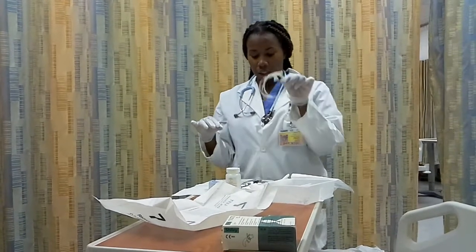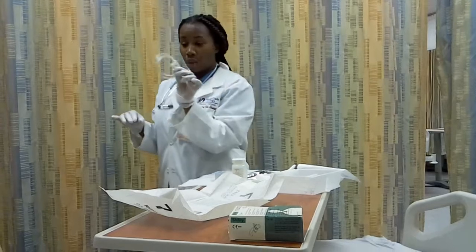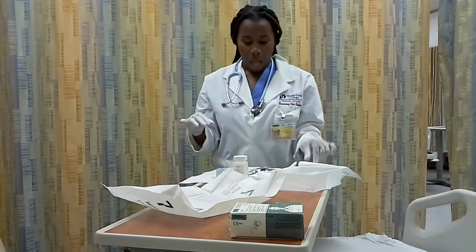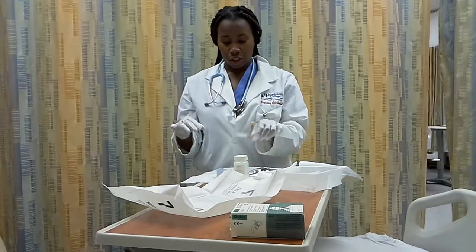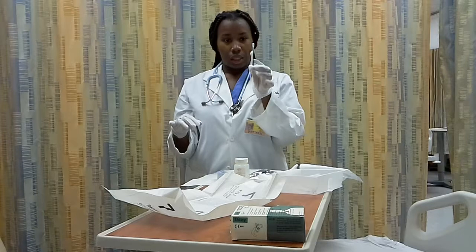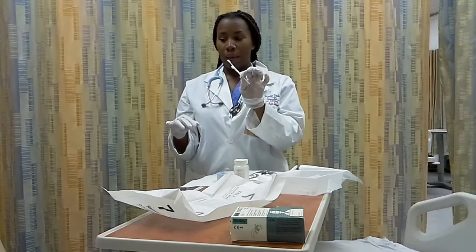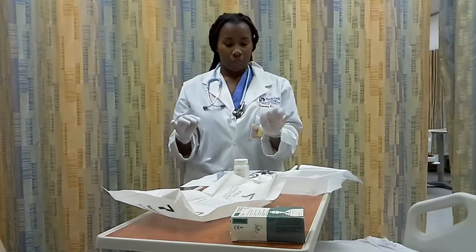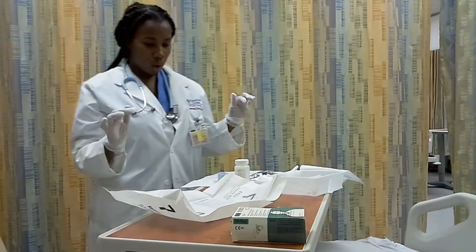I also have my suction catheter, which I would use to suction my patient after I hyperoxygenate him. I also have a scrub brush to scrub the inner cannula, and I also have these cotton applicators. This will help me get into the crevices that I can't get into with the gauze. So I'm going to go ahead and start.